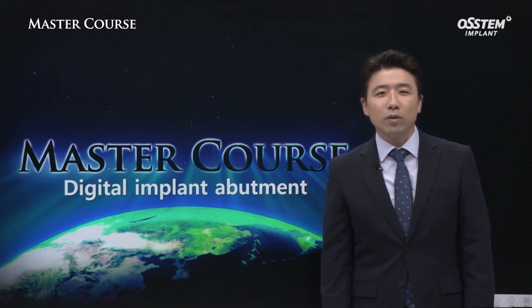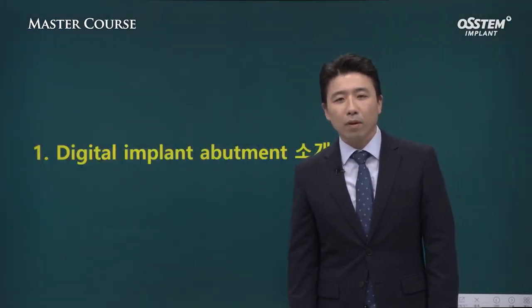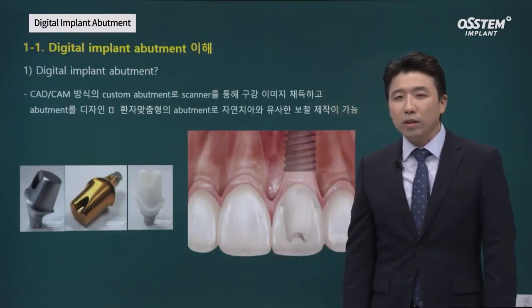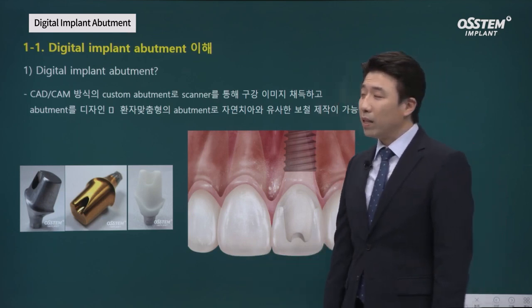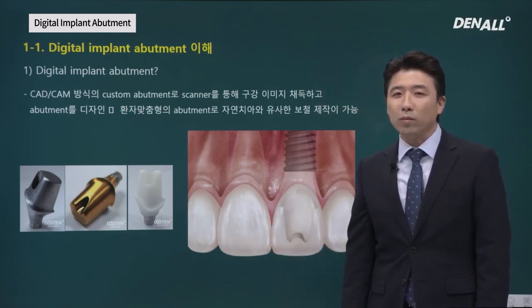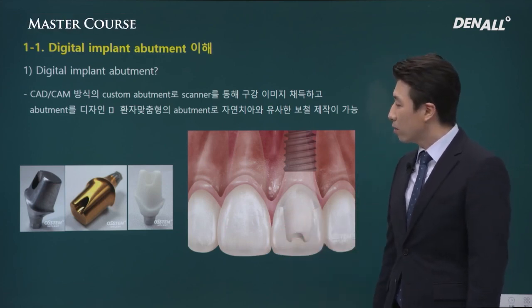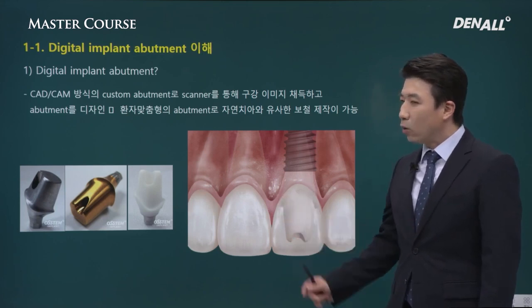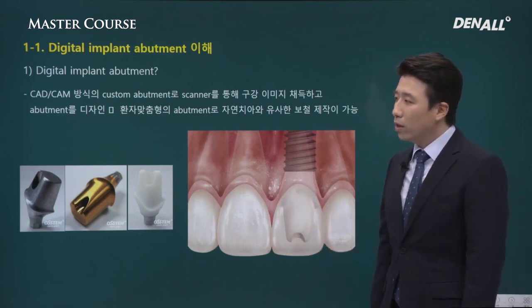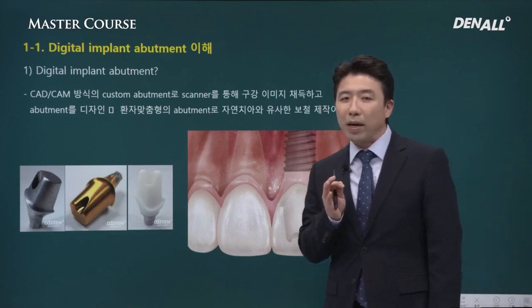Today we're going to talk about digital implant abutments. Recently, many are fabricating abutments using CAD/CAM method. Those with considerable experience might recall that in the past we used to use stock abutments. As of late, with advancements in fabrication techniques and designing techniques, many people use custom abutments.